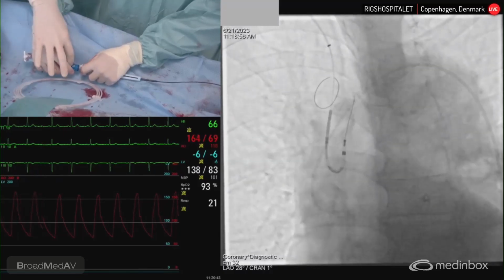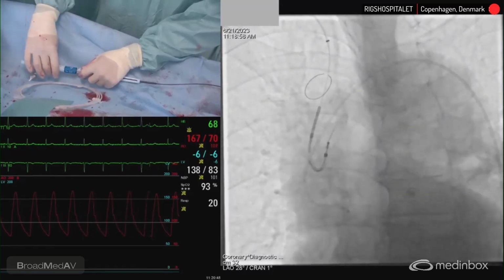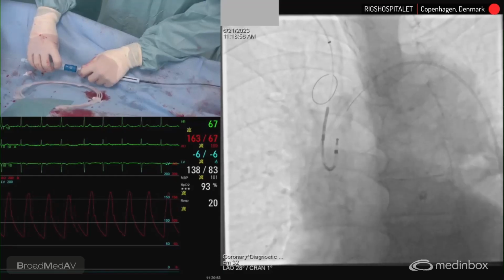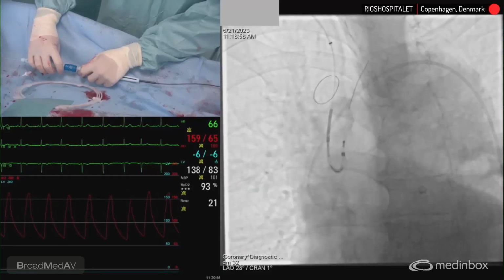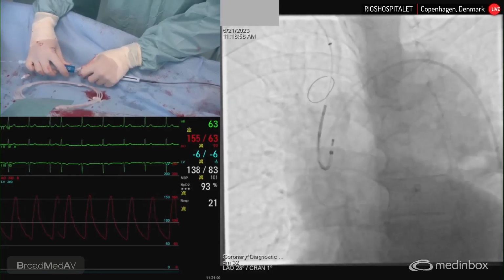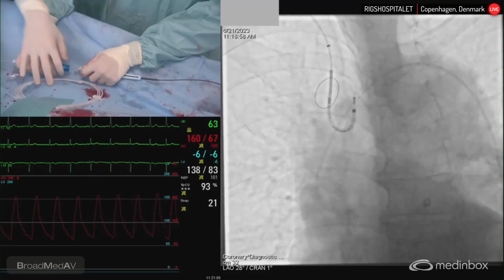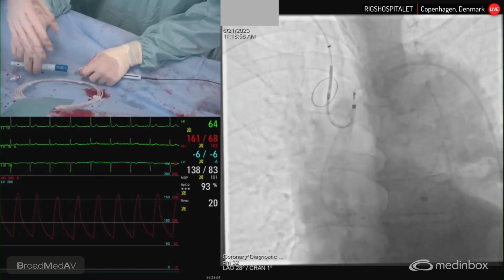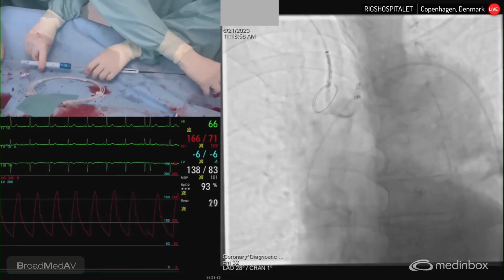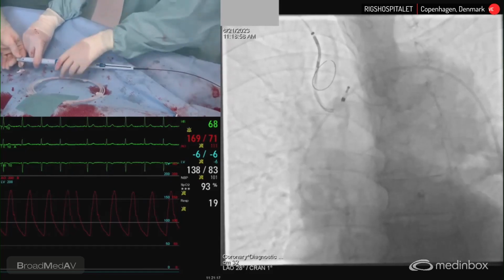But if you turn the whole handle, you don't turn knob 1. Then look, Alejandro, wait. No, then you just turn here. All right, that's good. Oh, you were very close. Yeah, you're in. And now you split the whole handle. I don't like it if you want to do things with the handle only. Your wrist, you just hold it here at the end. Don't use that knob 2 there. You're fully split. But you can still pull a little bit on everything, probably to get it more to the carina. I think we're good there.